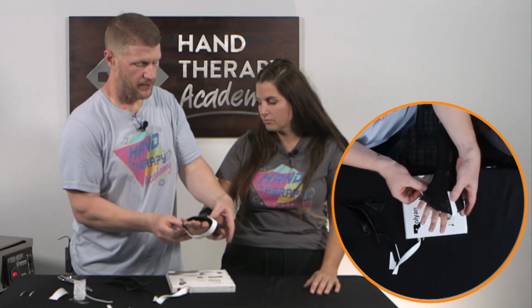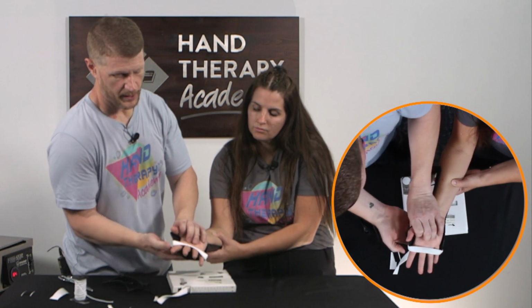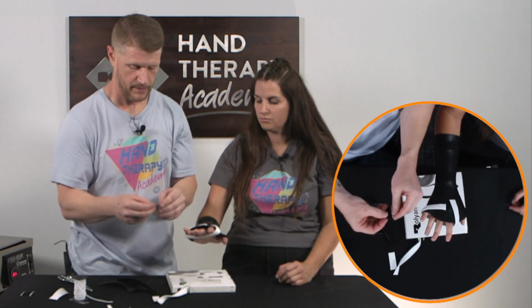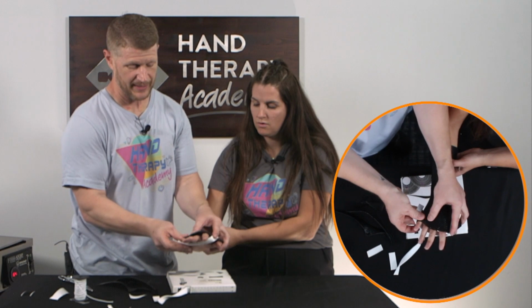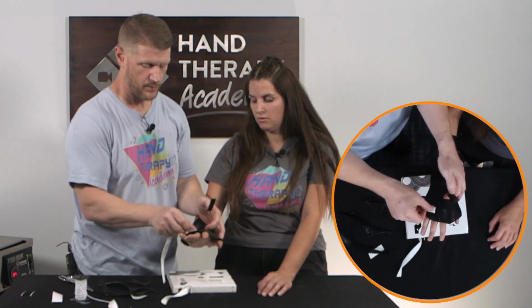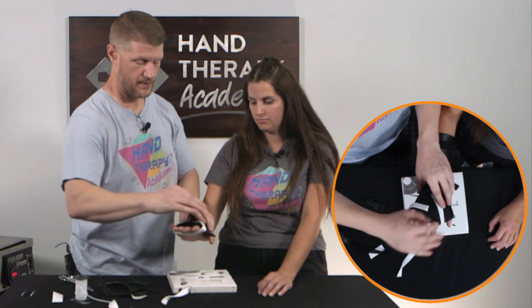So if I want to follow through that same line on both sides, let's flip over here so you can see I want it coming across P1s, right? I want it coming across there, so it's going to support those. And the thread I put through later will help guide that and put it where it belongs. So I'm going to take these two, and that's going to be my guide where that strap naturally laid, okay? A lot of times we like to do continuous strips, but these, you've got to target a little bit more, so it doesn't quite work as well. So again, coming across P1s and across here, I'll use that as my guide as to where to put that strap. So that's what we're looking at.